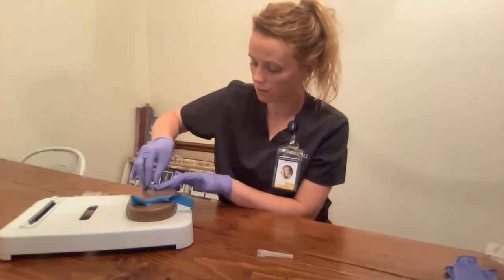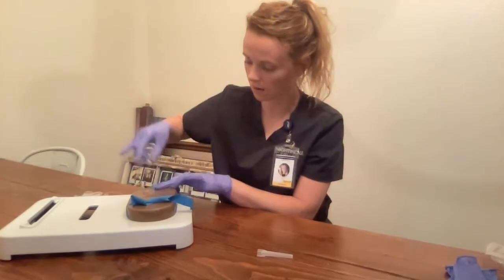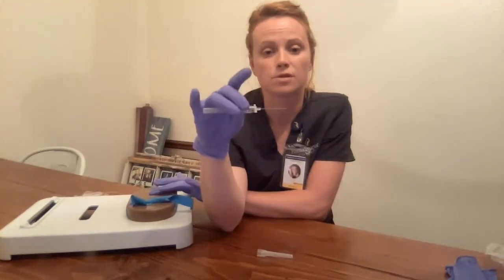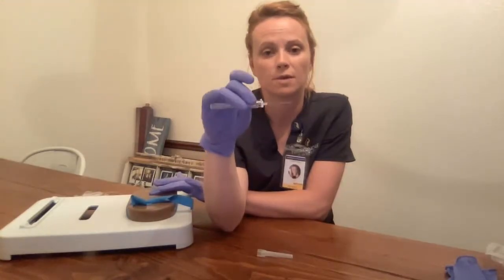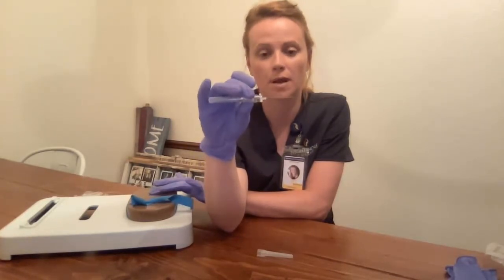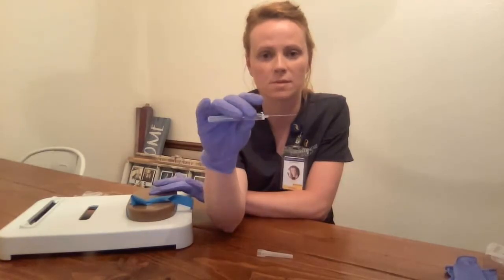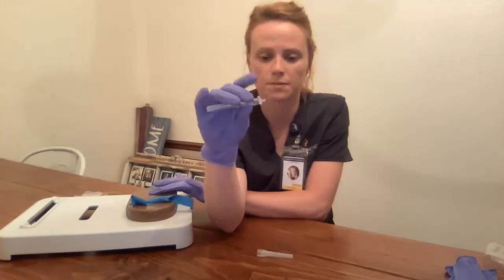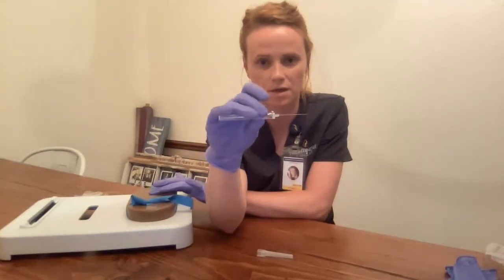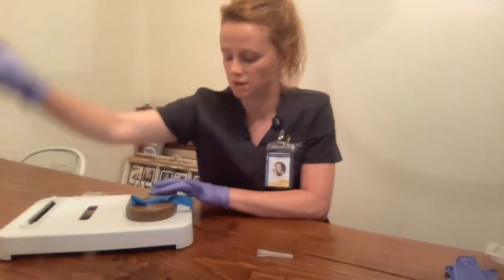Then I'm going to remove the catheter here — remove the needle from the catheter. Anchor the vein. Now, I'm supposed to press this button to withdraw the needle into the plastic tubing here. This is my last needle; I've gone through all of them. So I'm not going to press the safety mechanism just because this is my last one. But in the real world, I would be pressing this white button — the needle will go into the tubing here — and then I would put it in my sharps container.